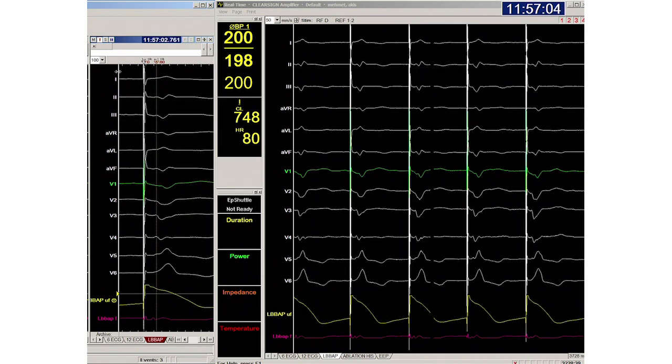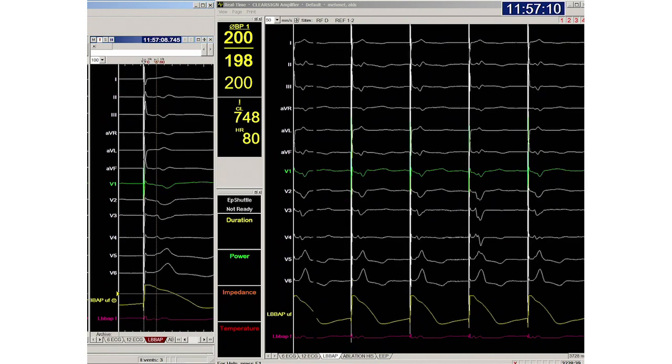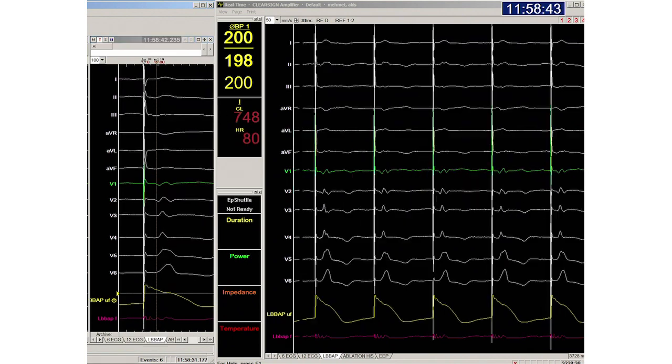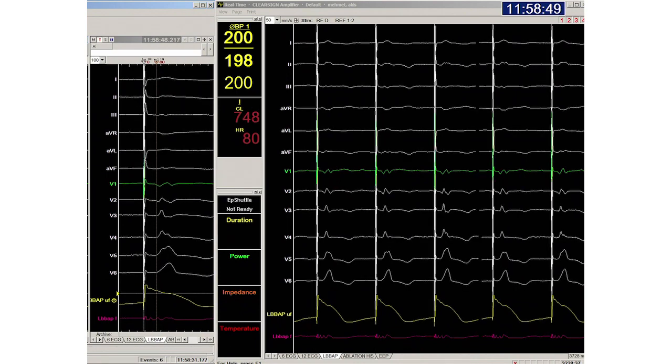The 12-lead ECG before onset of screwing shows a W pattern in lead 1, a wide QRS with fragmentation of the R wave in V6. Using EP software may be helpful, where the left part of the screen shows the triggered slow display of the QRS. During screwing we can see the emerging R' wave in V1.